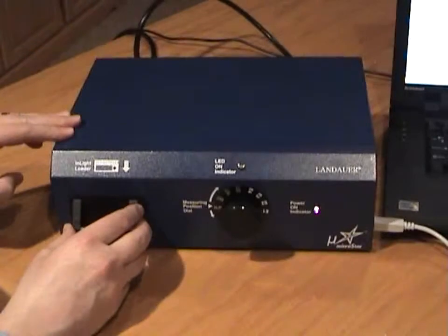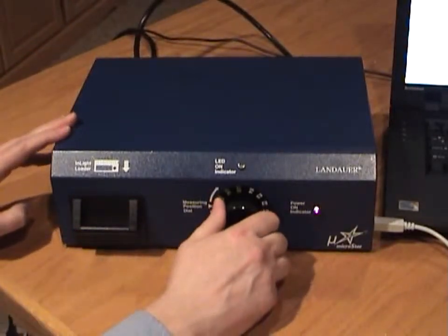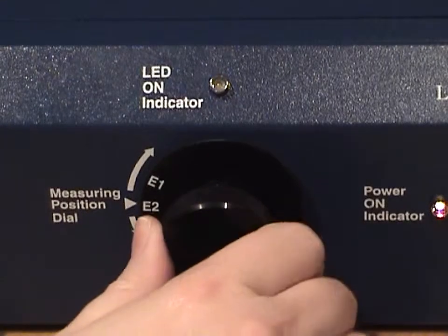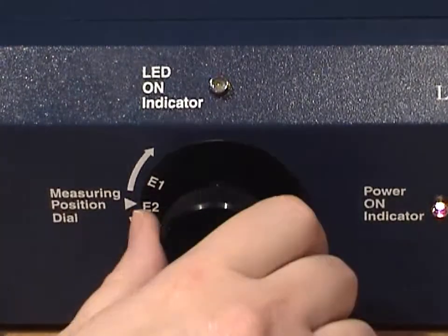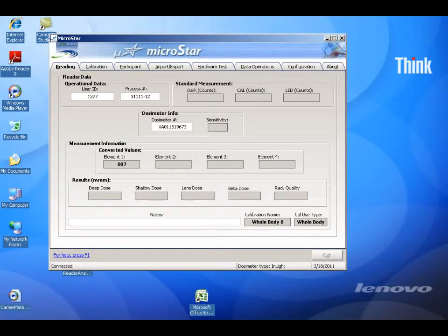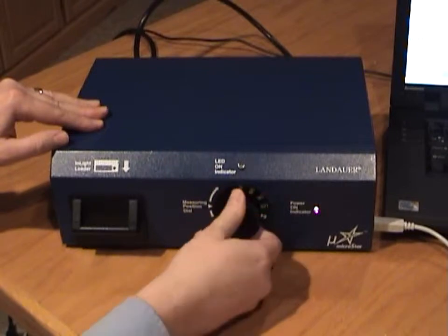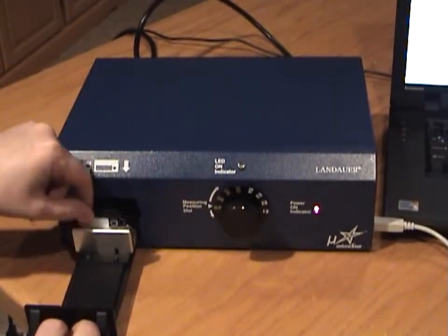Close the drawer completely — you should feel it snap closed. Turn the positioning knob clockwise to the E1 position. When the LED indicator turns off, turn the knob to position E2. Repeat this for each of the four element positions. Once element 4 is completed, the dose will be calculated and displayed. Turn the knob counter-clockwise to return it to the HP position, then pull out the drawer to remove the dosimeter. You can either document the dose or use the reader's exporting functionality to export the data after all dosimeters have been read.